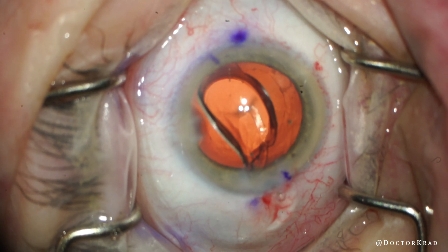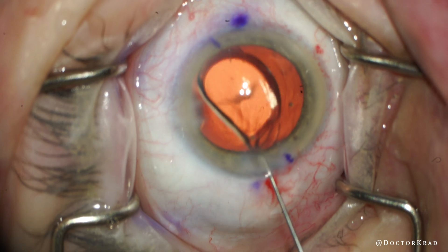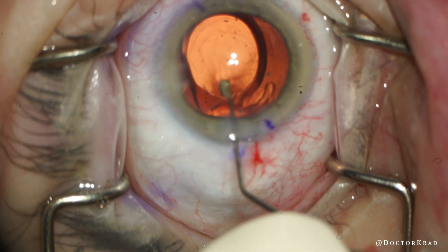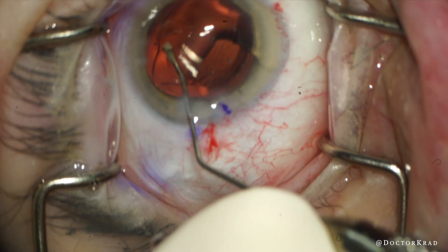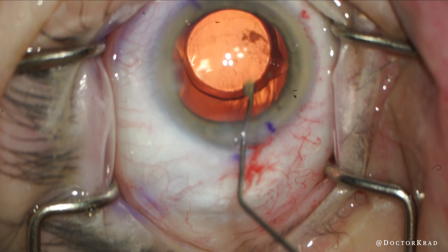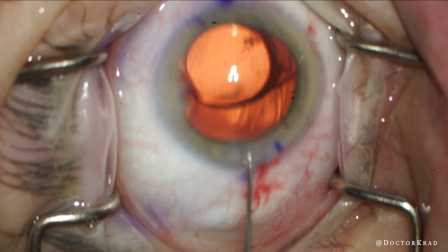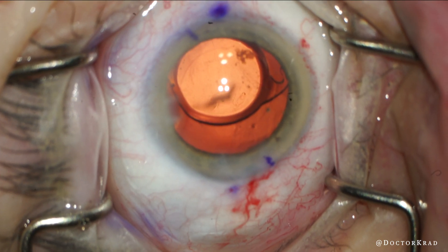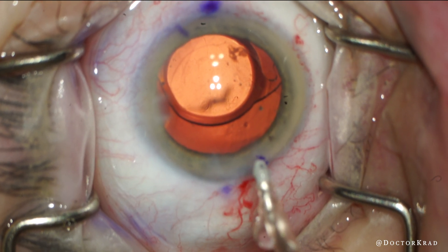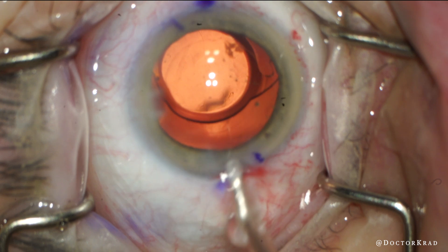We took out the cataract and now we've implanted the lens implant. It's a toric lens so I'm going to align it appropriately, but before I do that I want to remove viscoelastic from the eye — from behind the lens and in front. I usually just tilt up the optic that way so I make space for my irrigating-aspirating tip to go behind the lens.